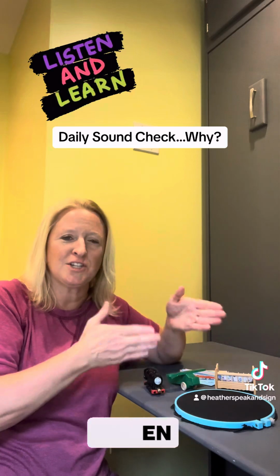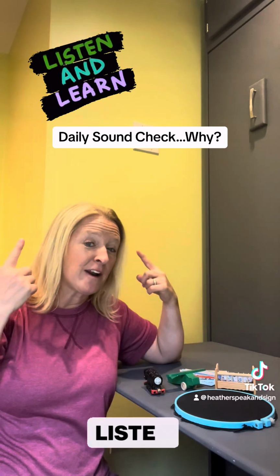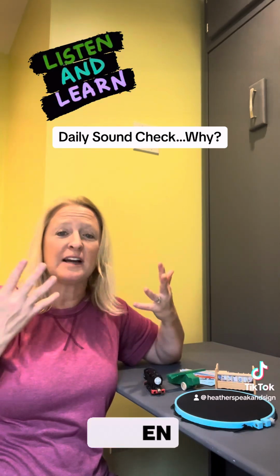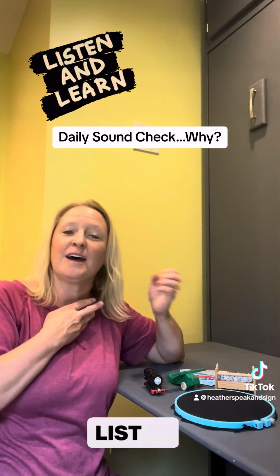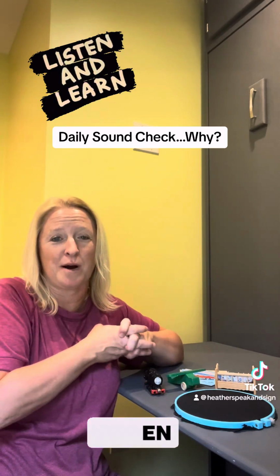But we should be checking equipment through listening every day. For students who are aided bilaterally, cochlears bilaterally, sometimes one is working and one is not, and they don't even quite realize it or have the communication skills to tell us. I also try to always remember to check one side, then the other side, and then both, at least once a week, so that we can make sure both devices are working properly.